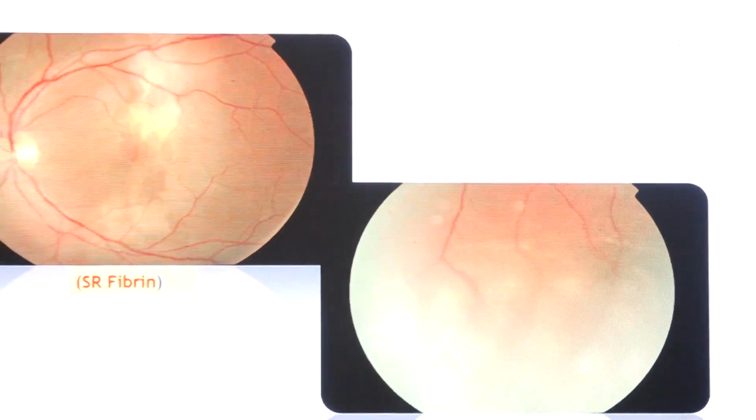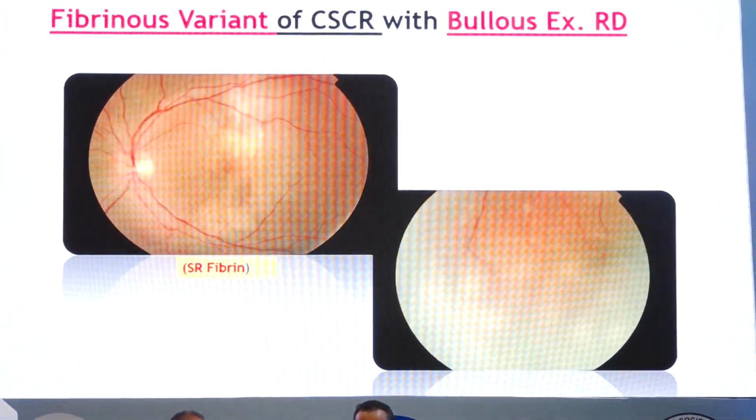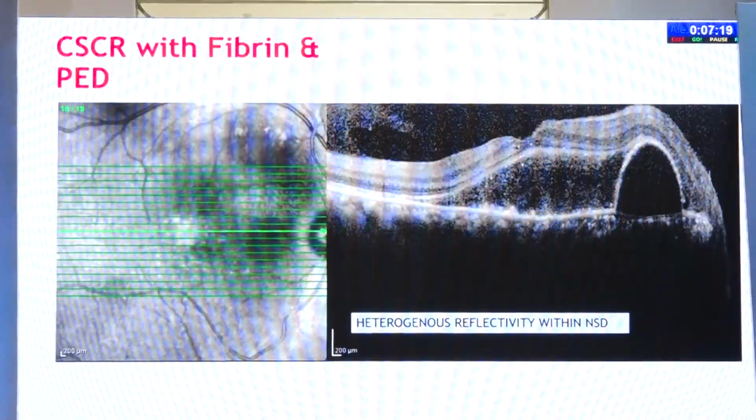As we know, swept source OCT in an acute CSC shows the serous macular detachment overlying a thick choroid with dilated outer choroidal veins, and we see variants with fibrinous exudation as well as exudative retinal detachment as more complicated types of central serous chorioretinopathy.